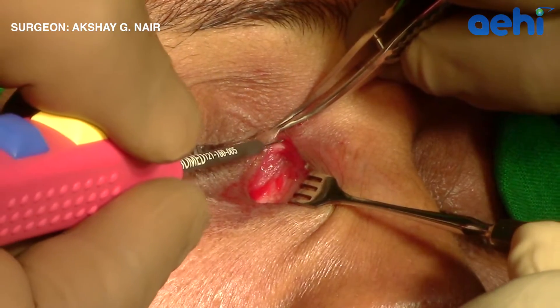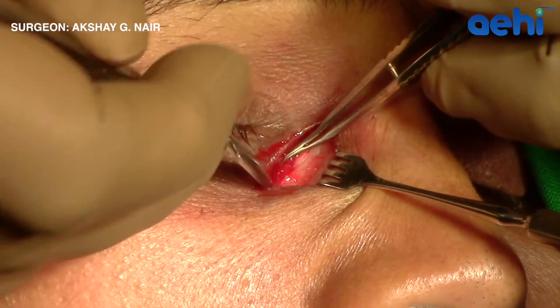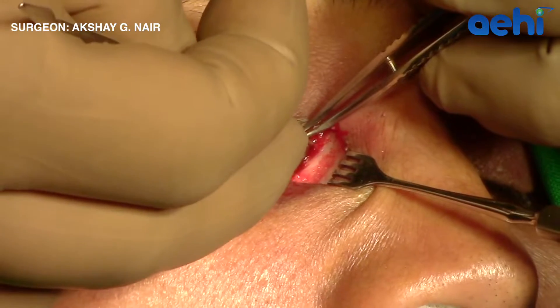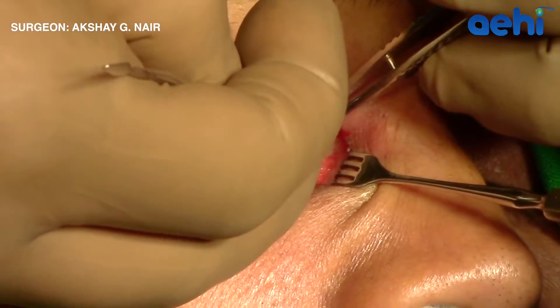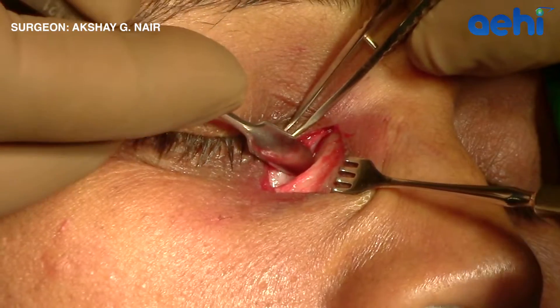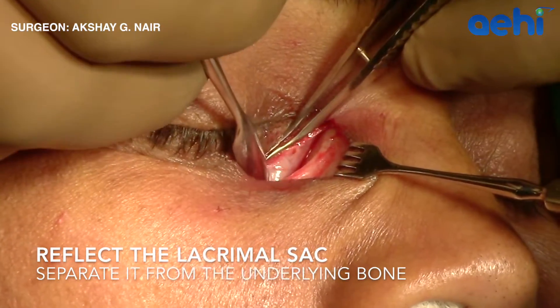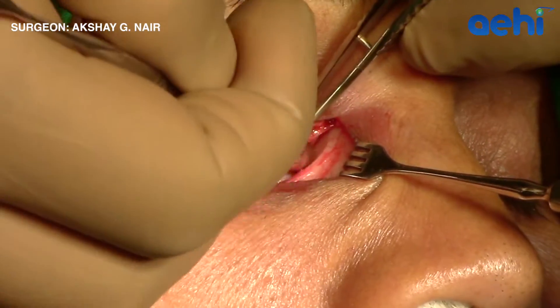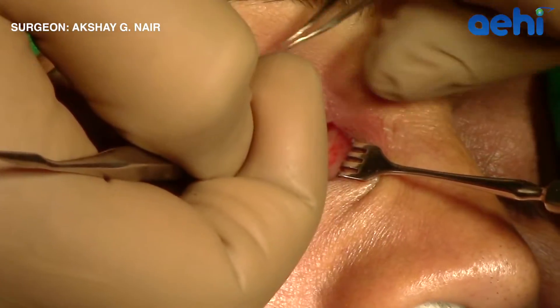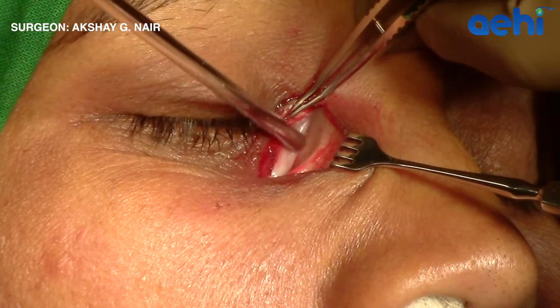It is important to cut this in order to access the fundus of the lacrimal sac. Using a periosteum elevator, the lacrimal sac is then carefully separated from the anterior lacrimal crest and the lacrimal sac fossa underneath. This is carried out right down inferiorly where the lacrimal sac continues as the nasolacrimal duct, and superiorly till the fundus of the sac is separated from the bone.